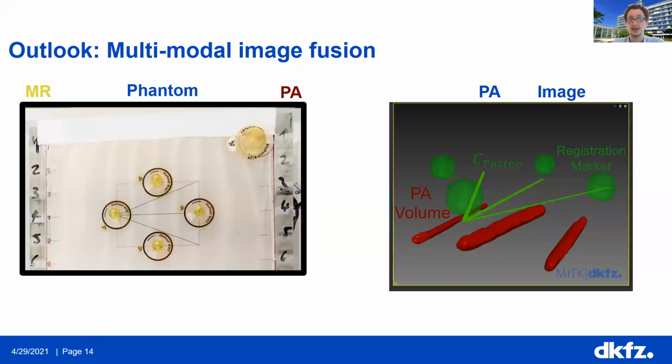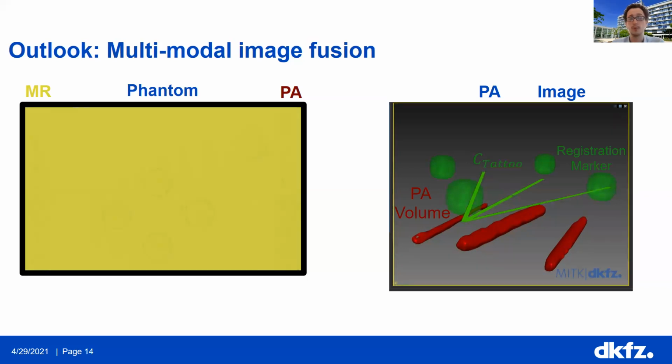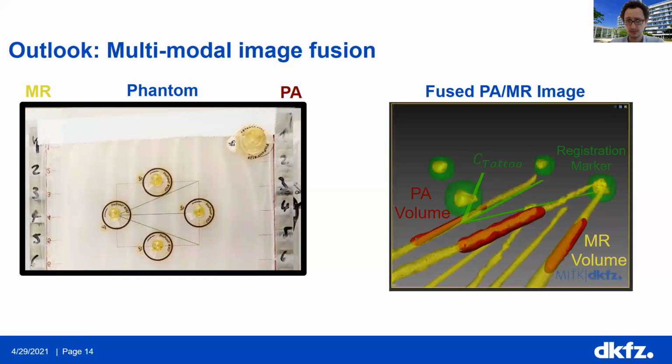We then attached predefined locations, MR markers, which are set relative to our optical pattern. We then made an MR scan and registered those markers.